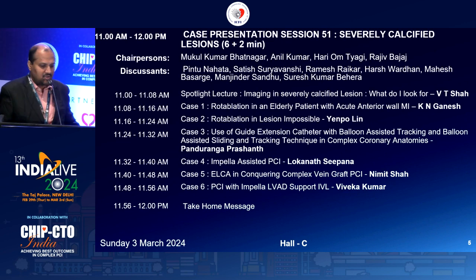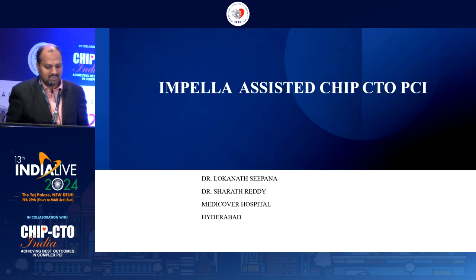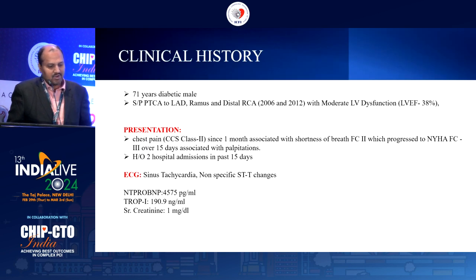Good morning, everybody. Today I am going to discuss an Impella-assisted CHIP CTO PCI. Here is a 71-year-old diabetic male who underwent PTCI to LAD and ramus in 2006 and to distal RCA in 2012, and he presented with moderate LV dysfunction.